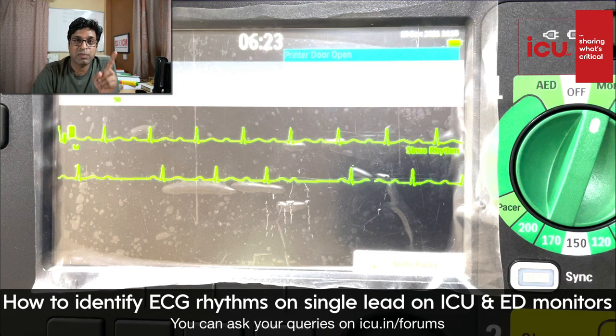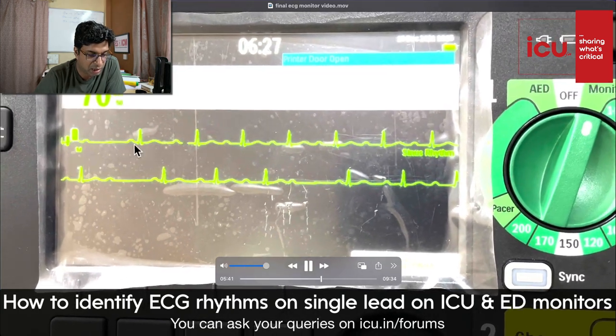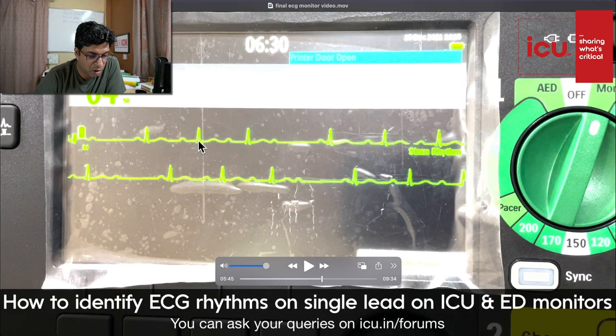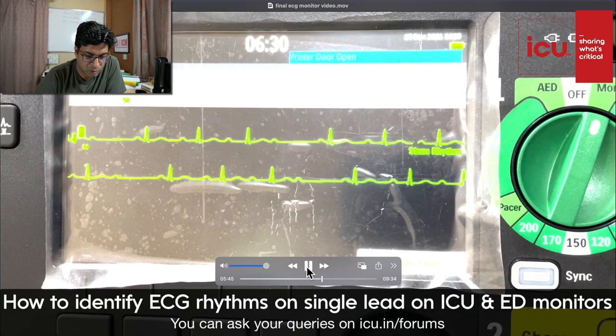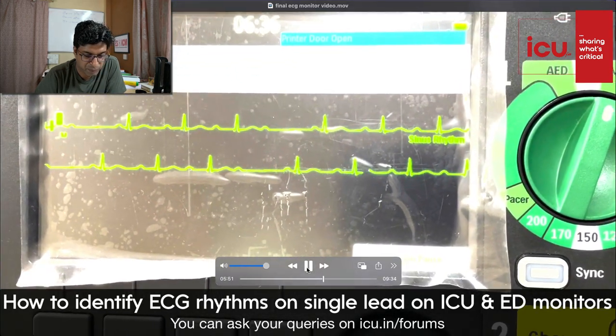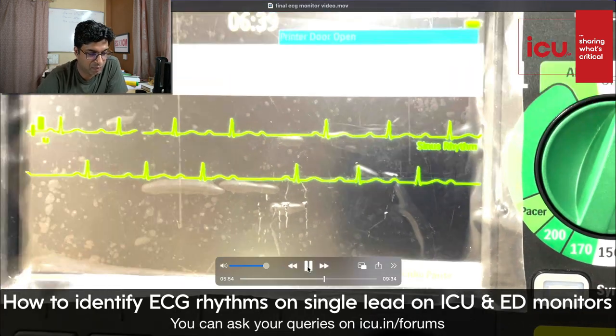So in Mobitz type 1, the PR interval gradually gets prolonged, and then there is a drop. In Mobitz type 2, it's unpredictable. It's coming at regular intervals, and suddenly there is a drop. So let's see. So it is Mobitz type 1. It's coming, a little bit of delay, and then drop. PR prolongs, and then we know it's going to drop. So Mobitz type 1. We call it Wenckebach phenomenon. This is also known as the Wenckebach phenomenon, type 1 block.